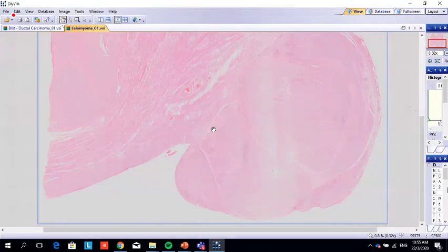Same thing as just now. Well circumscribed, right? One of the features. So no invasion means, also, is it metastasized? No. We said the main features to see are no metastasis, no invasion. This is the important thing. Then you come with other things: no atypia, no necrosis. Hyalinization in leiomyoma is acceptable.